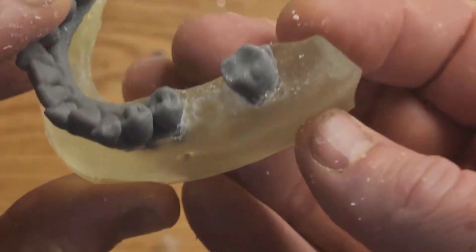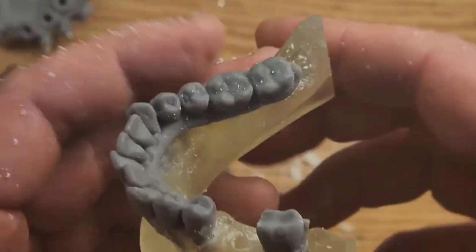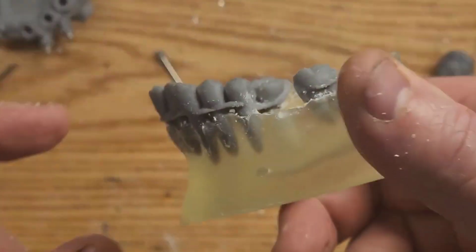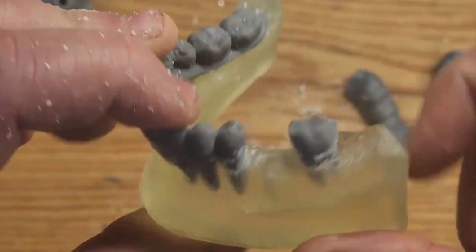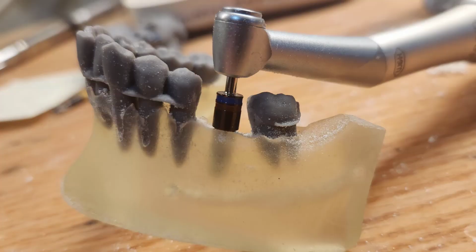So that's the end of it. Sorry for the choppy video, but I'm splicing a bunch of stuff together. Again, this wasn't originally intended to be a going-out-to-everyone tutorial. But if you want to make study models, this is great for mock surgery. For courses, this is something we do so that students can treatment plan a real CT and then actually do that same surgery on a model.